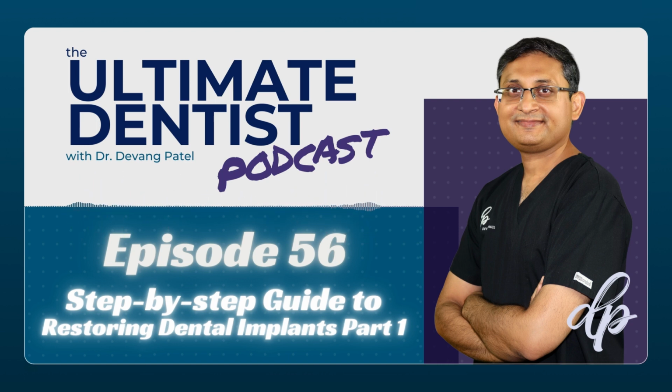There are different complications you have with occlusal overload, tooth versus implant. With the tooth, you see wear facets, abfraction, fremitus, attrition, and mobility when you overload it. Whereas if you overload the implant restoration, you have porcelain fracture, implant fracture, screw fracture, abutment fracture, possible screw loosening, or you can get bone loss or pocketing.